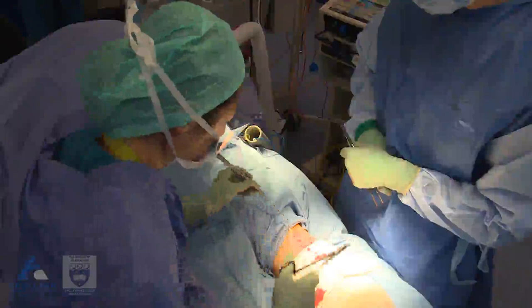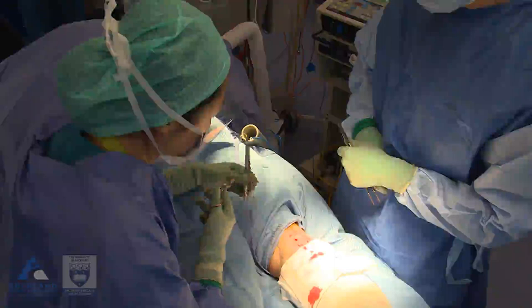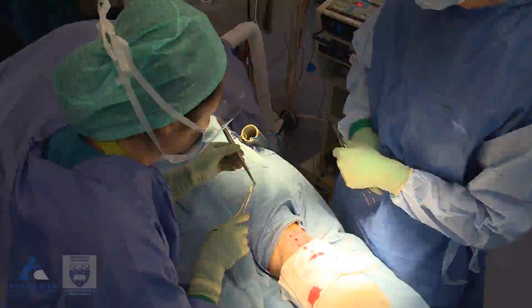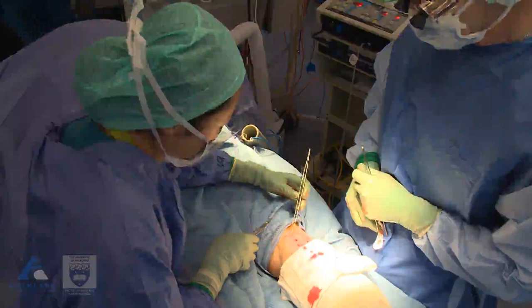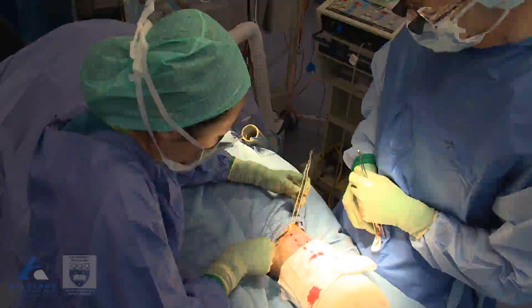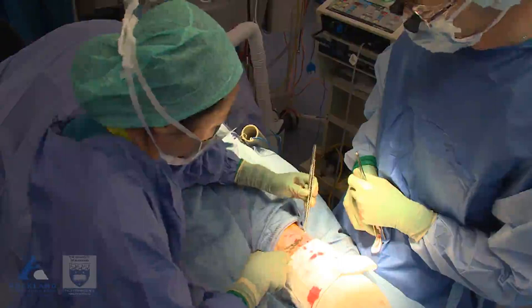Very good. You're loading it backhand now. That's one of those tricky things that probably takes a bit of practice — you had it right almost exactly the first time. And coming through, taking a bite on the side superficially. You can do that in two bits or you can do it in one if it's lined up. This is why putting the needle on the way you want is important — you can usually do it in one go. Notice that the angle of the needle helps if you're going to take the second bite.